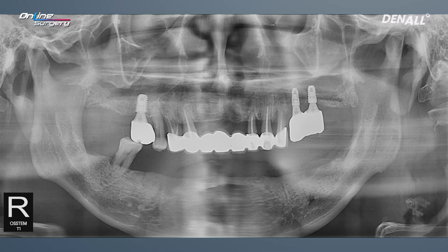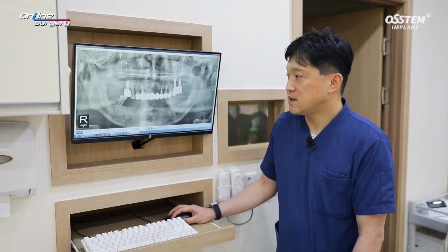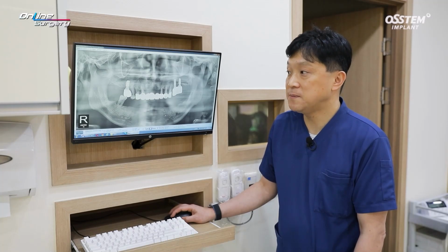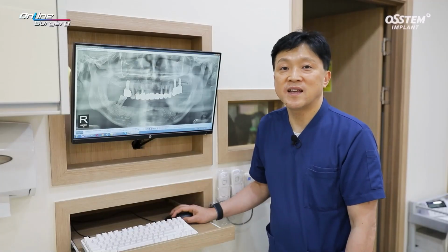Surgery is going to be done using OneGuide. Total of 8 implants will be placed, number 33, 34, 35, 36, 43, 44, 45, and 46. If you look at the patient's ridge, there are no major precautions that need to be taken. As for GBR, after placing implant in number 46 in the remaining space in the format of gap filling, bone graft will be done. Let's look at the surgical clip.